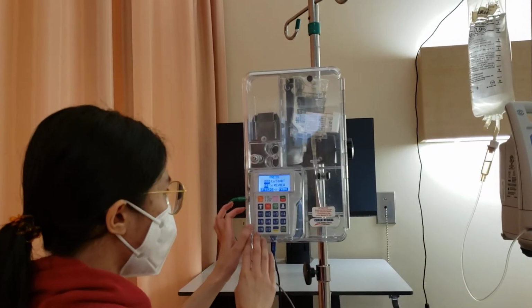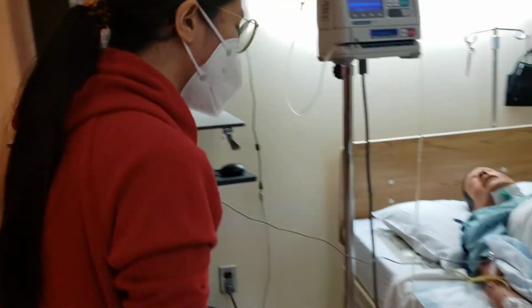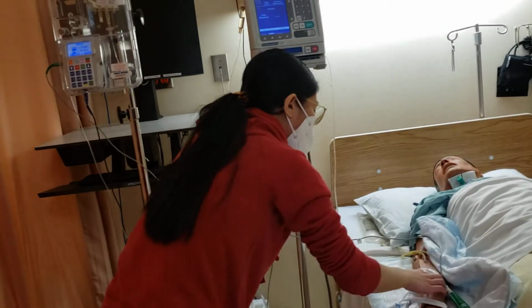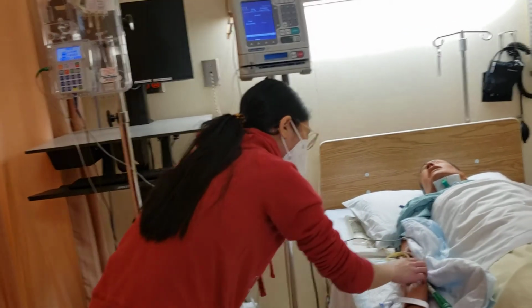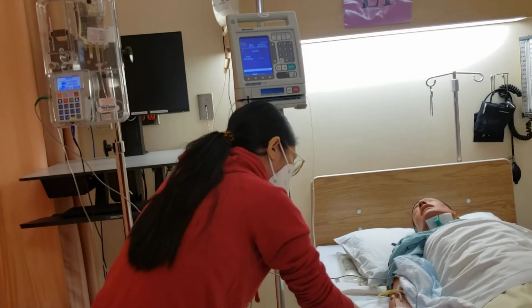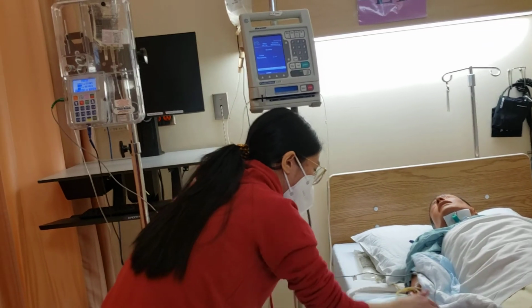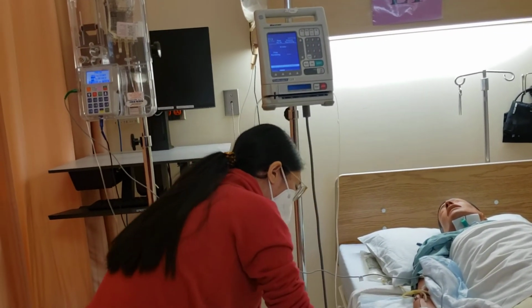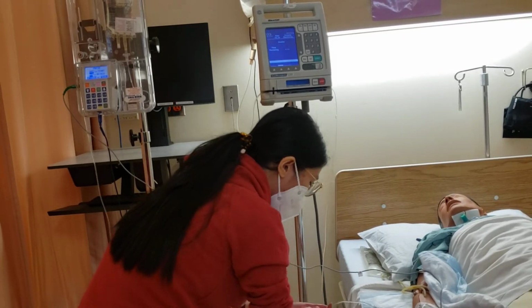Once you close this, before you start, make sure that we ask the patient if there's any pain on the side of the IV, or if it looks red, or if there's pain in here, it looks patent, and there's no leaking that's happening. Make sure that it's not clamped.